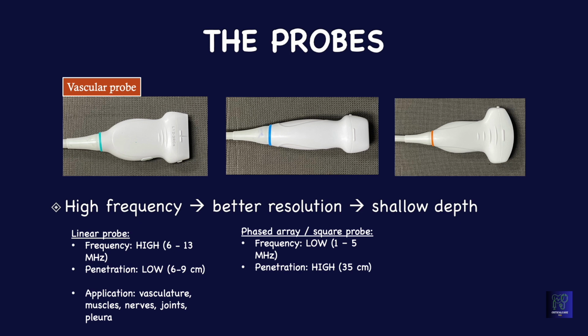Probably the most commonly used probe in point of care ultrasound exam is the phased array or square probe.